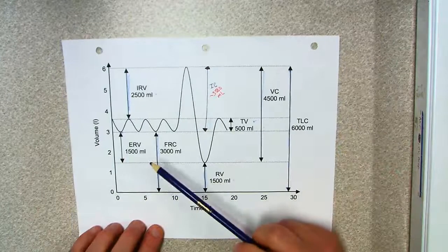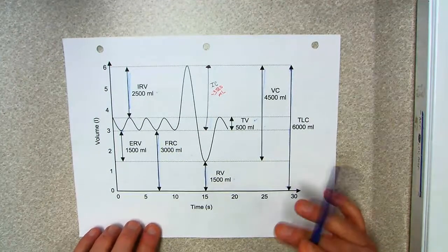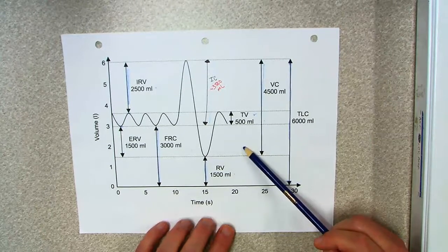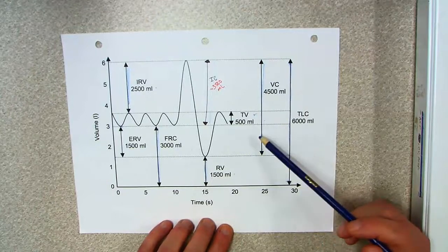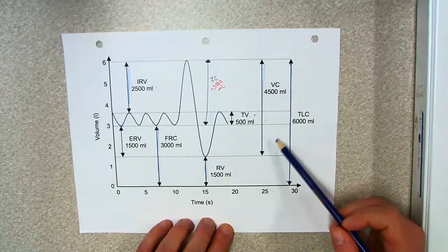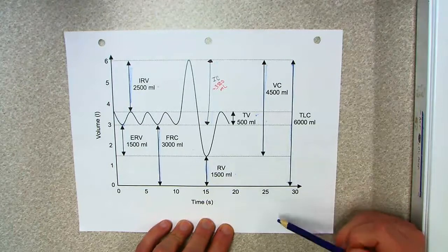By looking at these different lung volumes and lung capacities, we can determine a person's respiratory situation and whether or not they are having some kind of ventilation disorder. This can include restrictive disease, which involves a decrease in the ability to expand the lungs. Typically when we look at a restrictive disease, expiration rates will be lower than normal, and inspiration rates will be lower than normal. Then there are obstructive diseases, which are characterized by blocked or restricted airways, in which case you will see expiratory levels that are lower than normal.